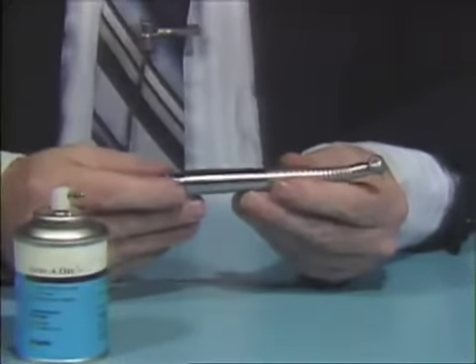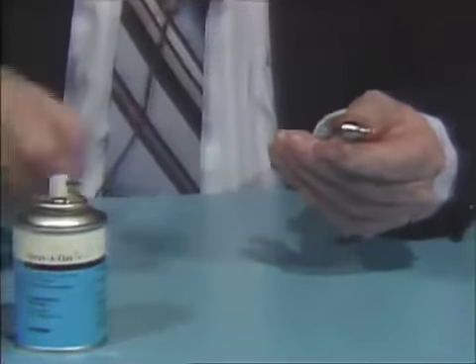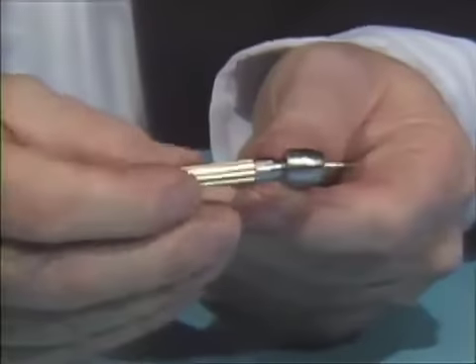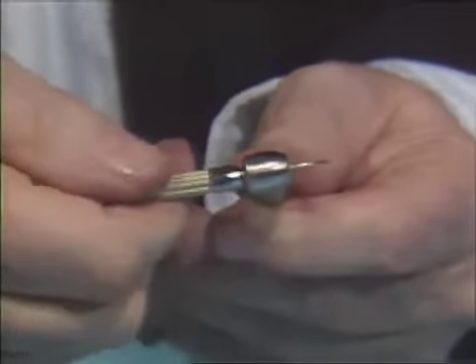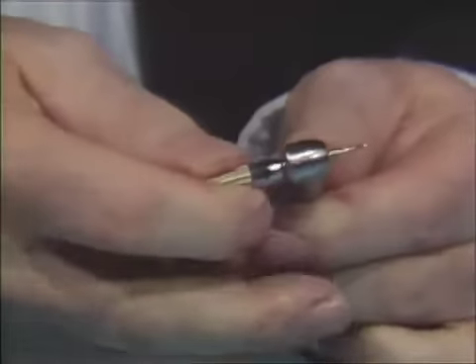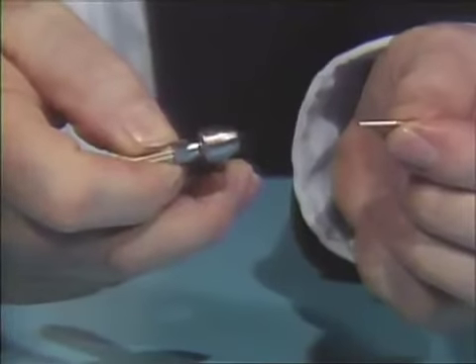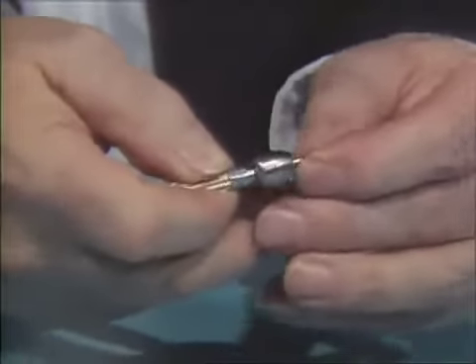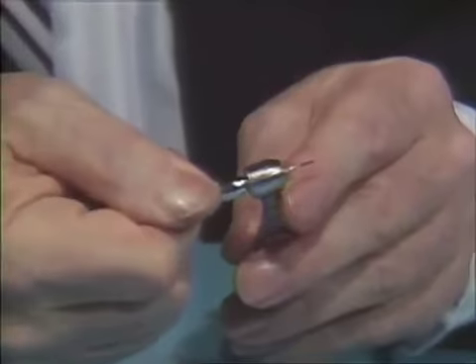To remove the burr, use the wrench and insert it into the back or cap portion of the handpiece. Make sure it is flush up against the head assembly or cap. Then loosen approximately a quarter to a half turn and the burr will be removed. To insert a new burr, place it in the chuck and tighten until snug.